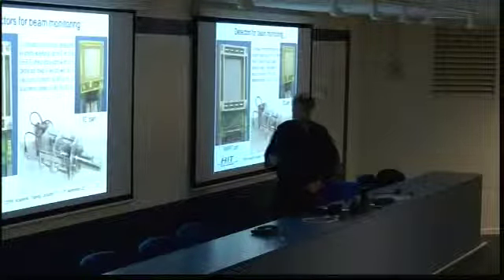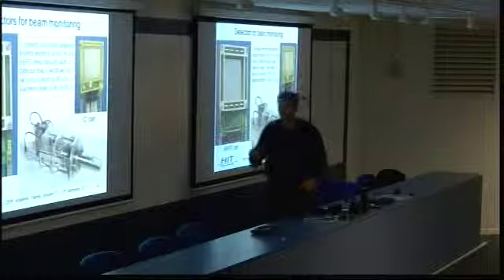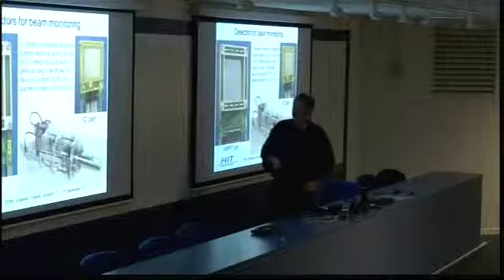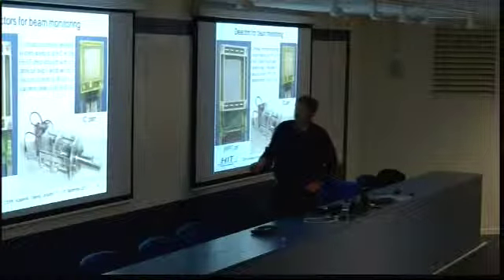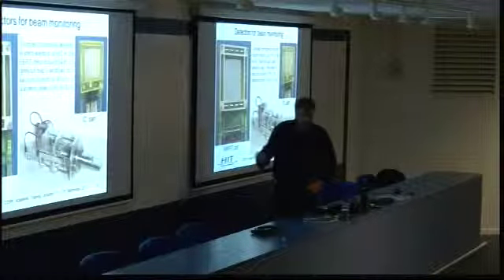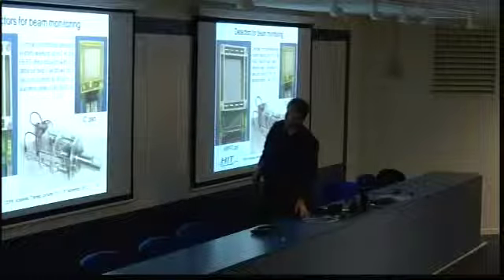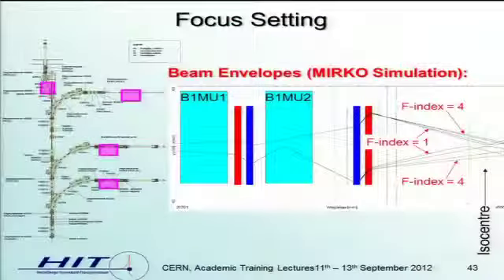We drive them in regularly in the morning during the quality assurance, and in case anything is not going very well, which is very seldom, normally all these detectors are clearly out because they cause straggling of the beam. Okay.